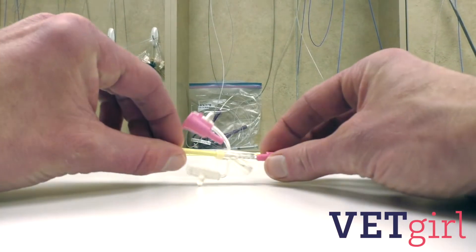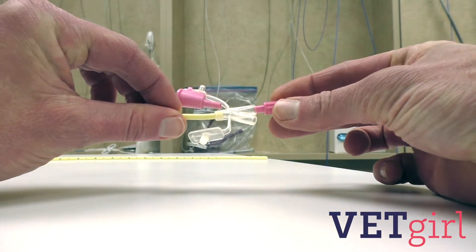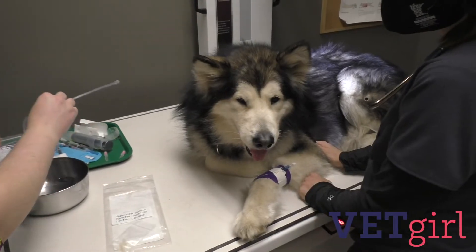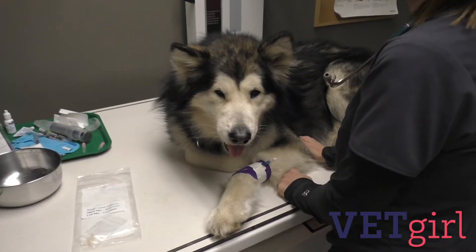Prior to insertion, test the stickiness of the stylet by removing the stylet from the NG tube, flushing saline through the tube, then replacing the stylet. This allows for easier removal of the stylet once it's placed. Lubricate the end of the tube with sterile lubrication.